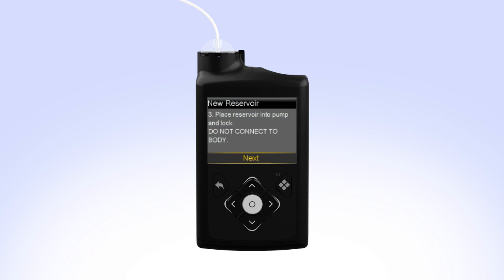On your pump, select Next to go to the Load Reservoir screen. With Load highlighted, press and keep holding Select until the screen shows Complete. When you see Complete, Do Not Connect to Body and a yellow check mark on the screen, select Next.